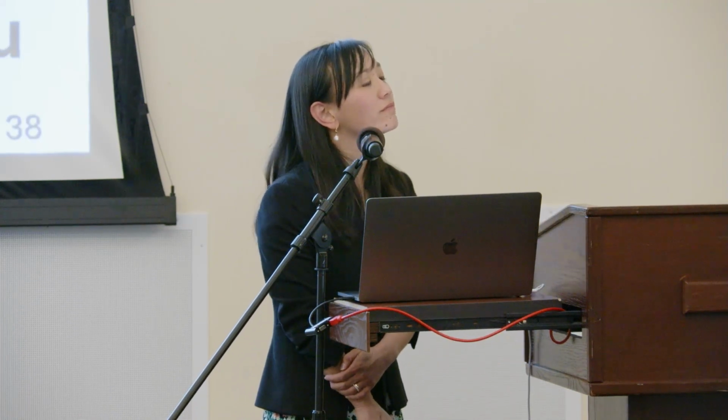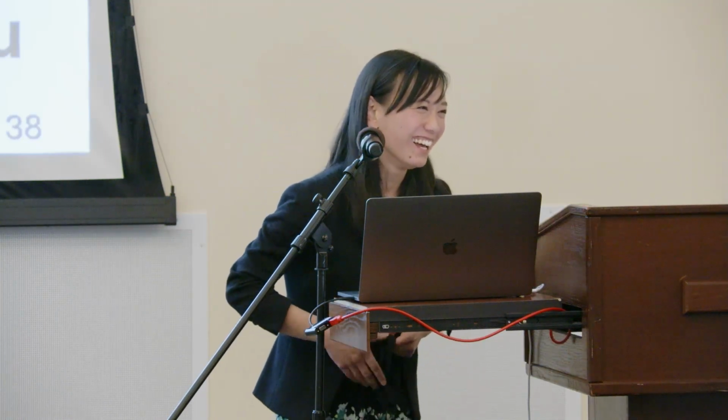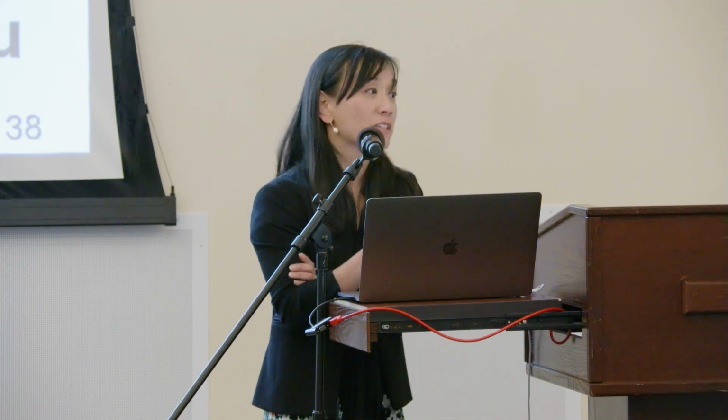If the MRI test depends on the oxygenation of the blood, what is the best time of the day to get an MRI test to get a more reliable and realistic result? That is a great question, and honestly, in terms of functional interpretation of resting state, whether having your eyes open or closed also makes a big difference. So in designing large-scale studies, you might want to be rigorous about recording time of day, but you're absolutely right. It varies a lot with time of day.